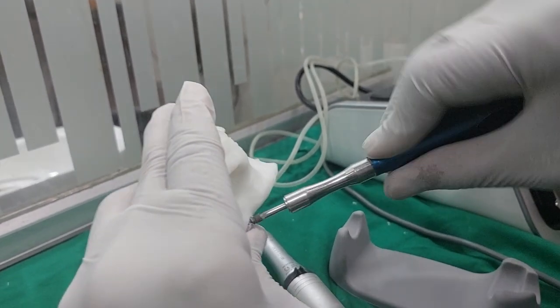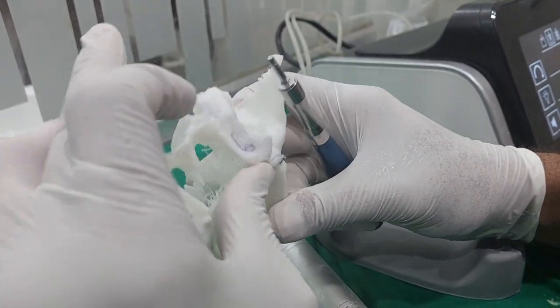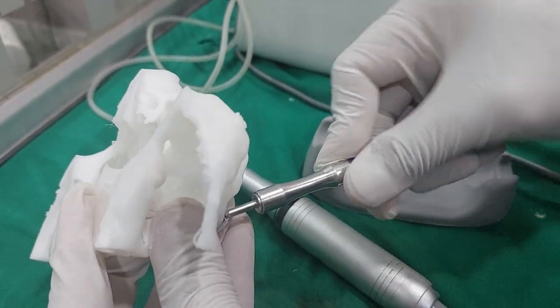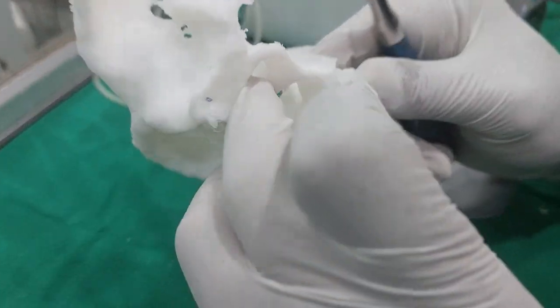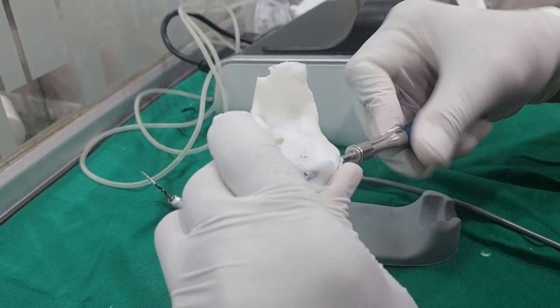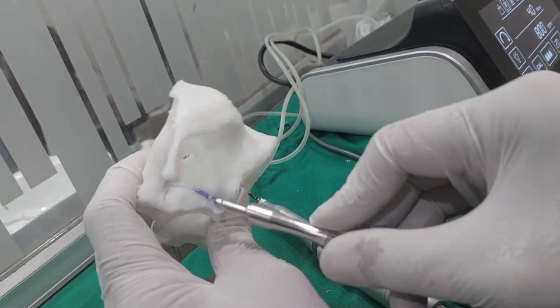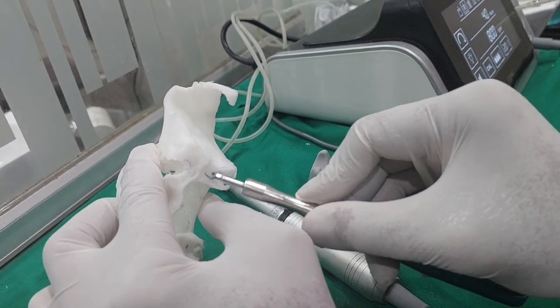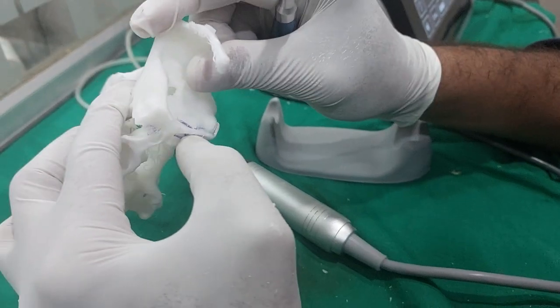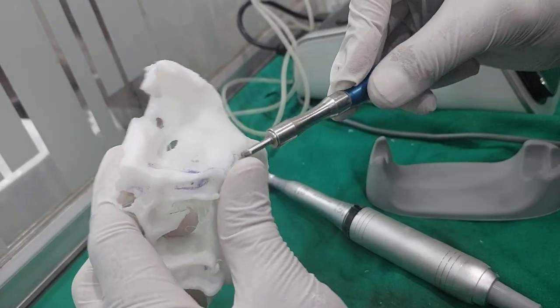The implant has come in with good torque. It hasn't fully come out but has reached that bone. If I put more pressure it will crack, so I'll stop. The tip has come out. This is the angle. If it touches the lateral or medial plate where there is muscle attachment, there could be an issue. If it is in between these plates, no problem. If the patient has symptoms, you can do wait and watch - after a few days symptoms will resolve. But if you literally target the plate, it will be harmful and you will have to remove the implant.